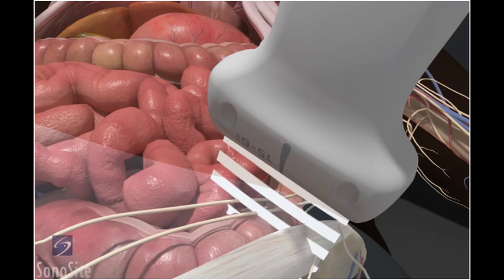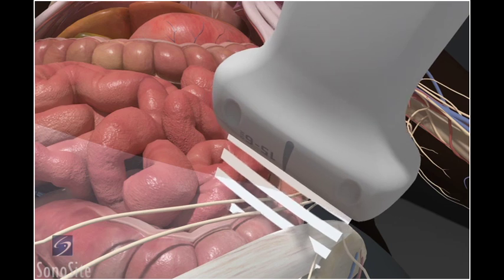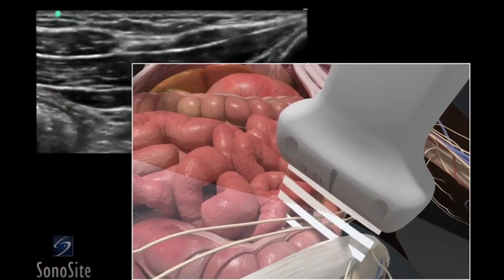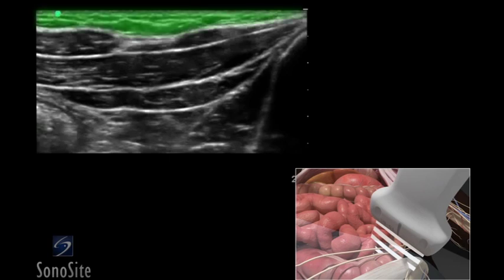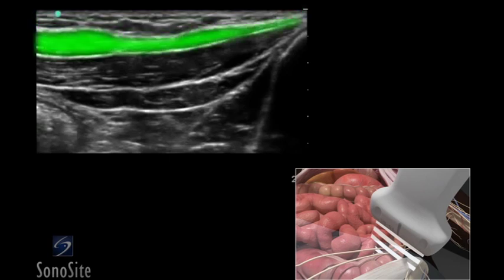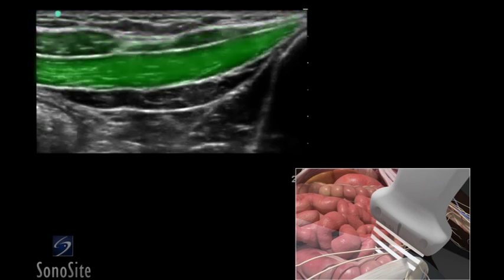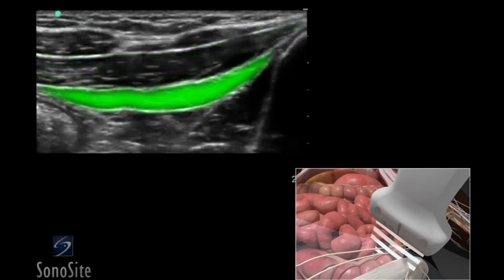The medial side of the transducer is slowly swept superiorly and inferiorly while maintaining the bony iliac crest in the lateral part of the ultrasound image. The structures of the anterior abdominal wall should be identified from superficial to deep, including adipose tissue, external oblique muscle, internal oblique muscle, and the transversus abdominus muscle.